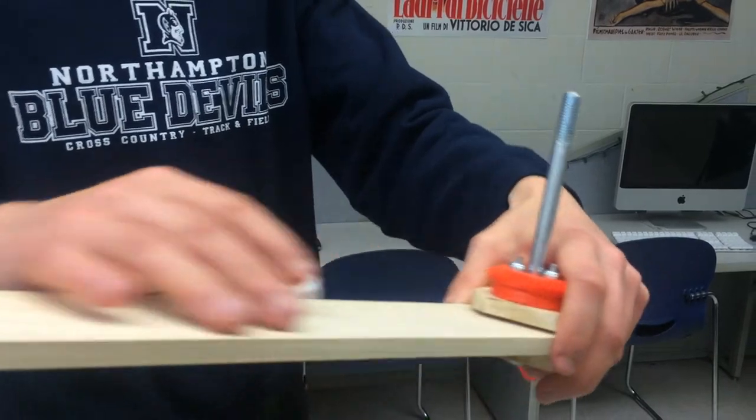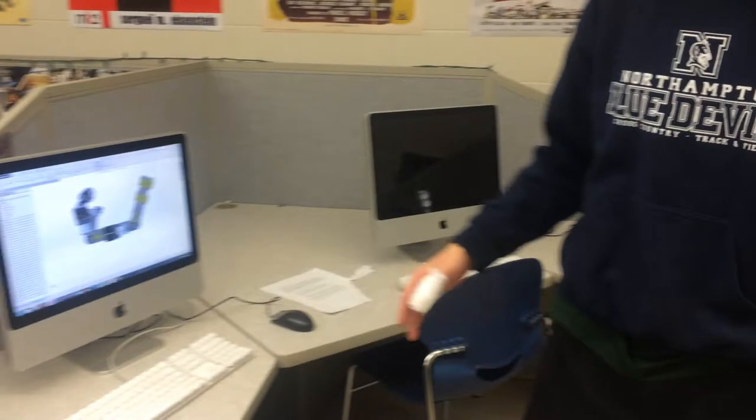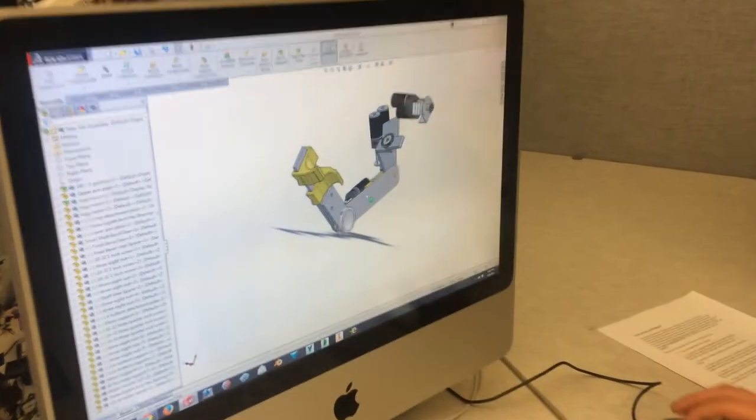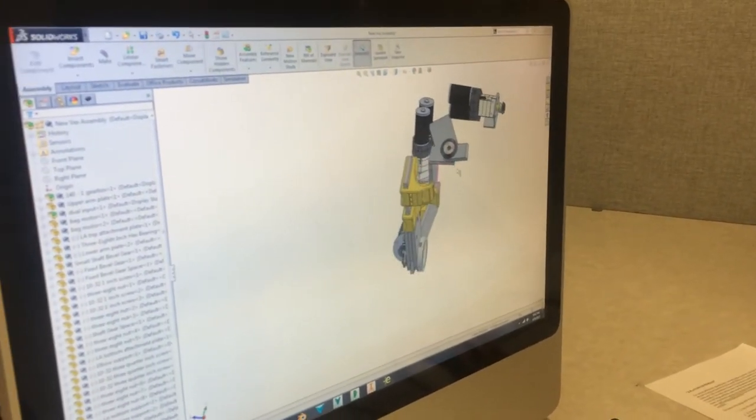There's also going to be one of those on the shoulder here, and on the CAD model, which is slightly more fleshed out, there are actually three points of actuation on the shoulder. You'll be able to move your shoulder in its full range of motion, which includes up and down, twisting, and left and right.